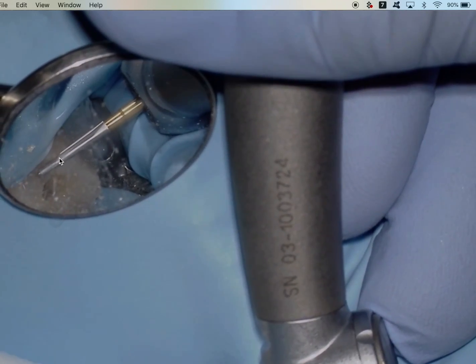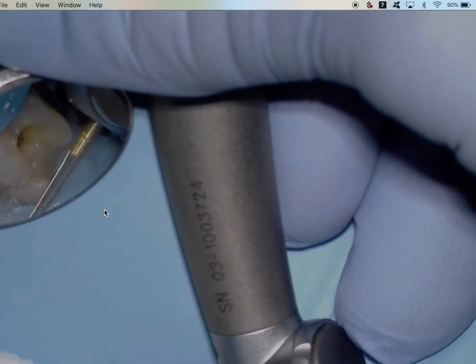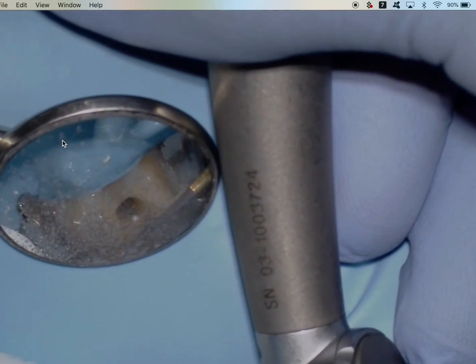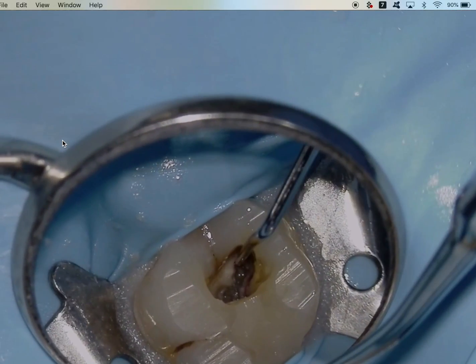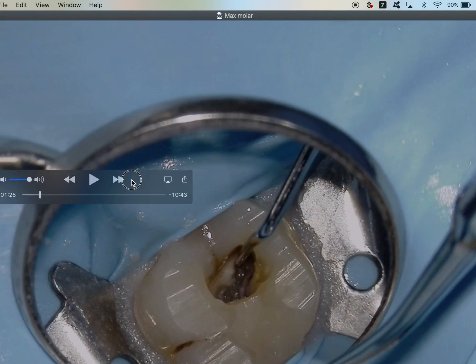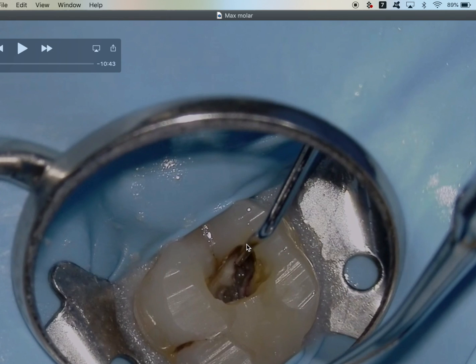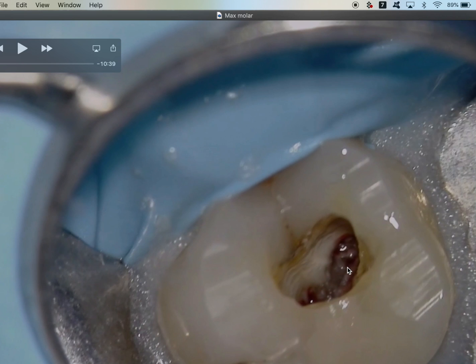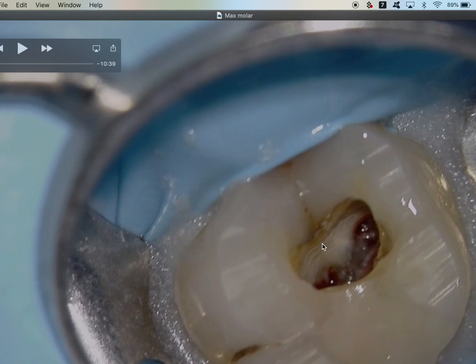Because this tooth is symptomatic to biting — symptomatic irreversible pulpitis with symptomatic apical periodontitis — I'm going to take it out of occlusion, and I'm also flattening these cusps because it makes it so much easier to get a stable working length. Here's the crack in the composite restoration; there's a posterior restoration here out of the way. This is our mesial buccal one orifice, our distal buccal is around here somewhere, and our palatal is here. This crack runs right down, and we're going to say the tooth is still restorable — it needs full cuspal coverage restoration.